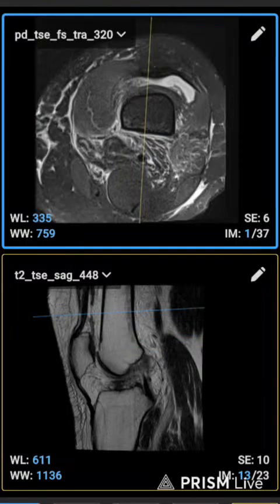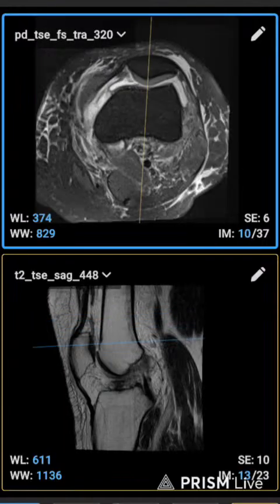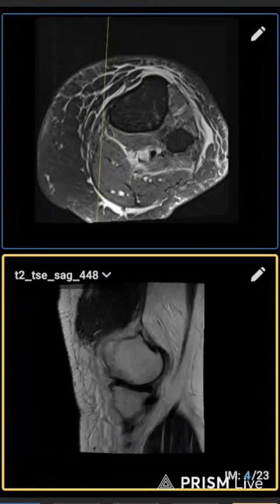This is the starting point of the axial slice, and after that you will continue up to here. Here you can see the fibula bone. The fibula bone is joined to the tibia at that level, so this joint is needed in the knee axial sequence.